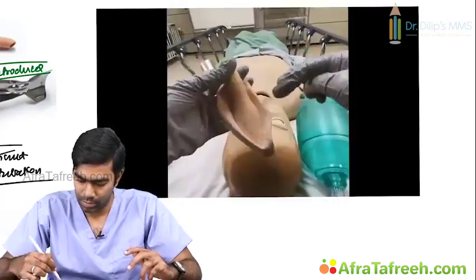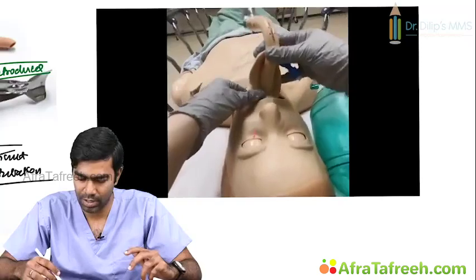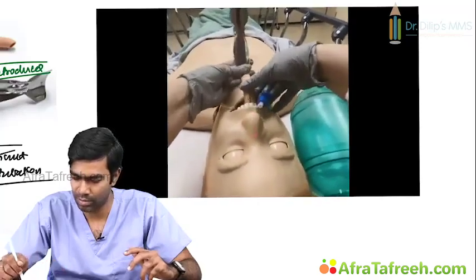So I think it's gone a little bit. So let us start from the beginning. This is how they insert. You can see you have an introducer and they are inserting this LMA with the help of an introducer.